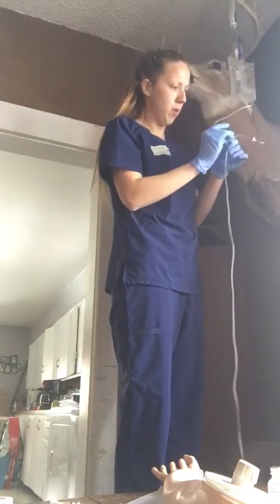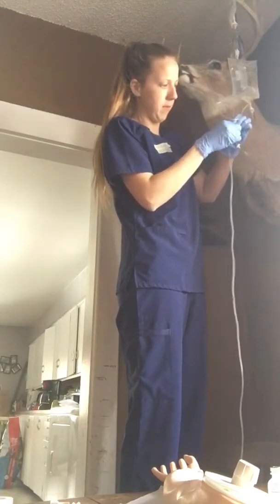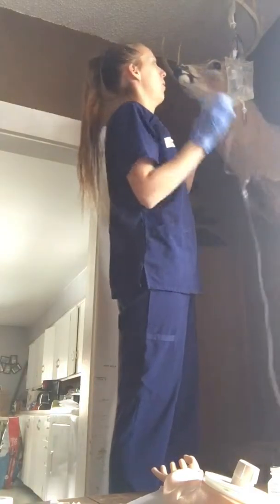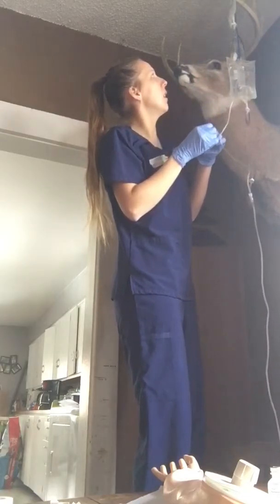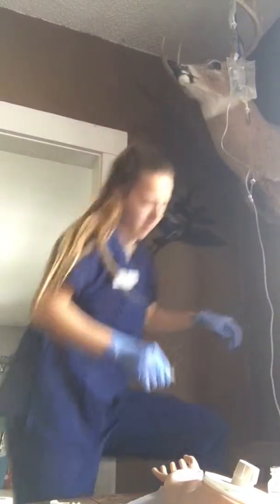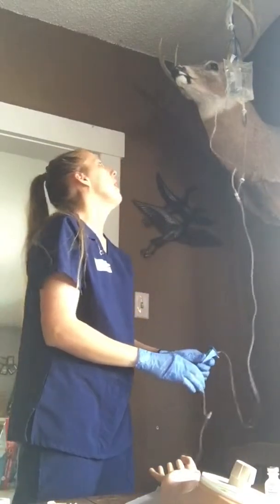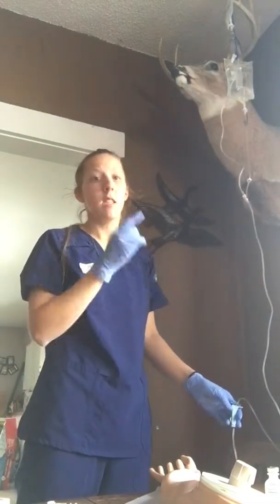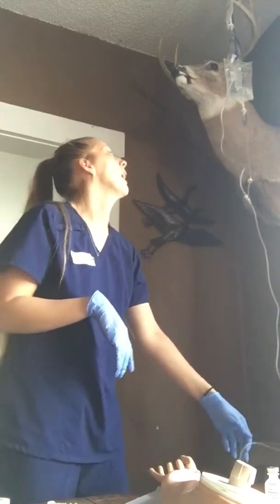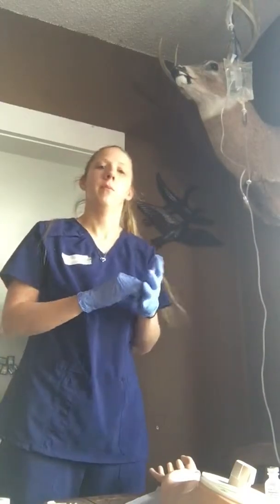I'm going to take another alcohol swab and clean this port here on the top. Then I'm going to set the drip rate. In 30 minutes, I'm going to come back and assess. This bag should be done in 45 minutes, so when I come back in 30 minutes, I'll ask her how her pain is doing and assess the bags as well.